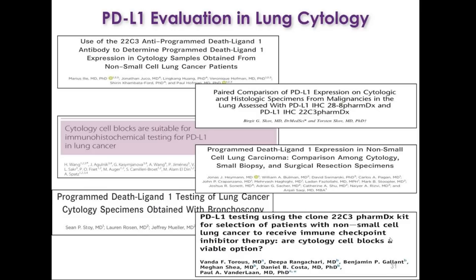You can't talk about IHC in lung without mentioning PD-L1. PD-L1 is now part of the NCCN guidelines for the required tests for non-small cell lung cancer. And again, when PD-L1 was first validated, it was not validated on cytology.